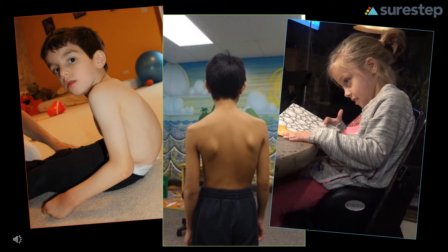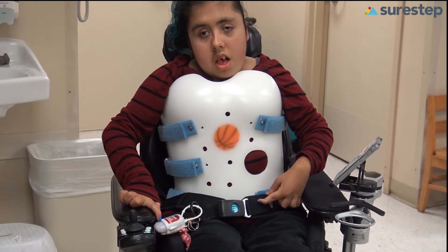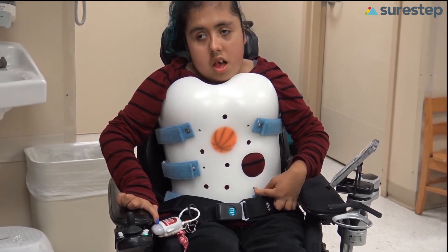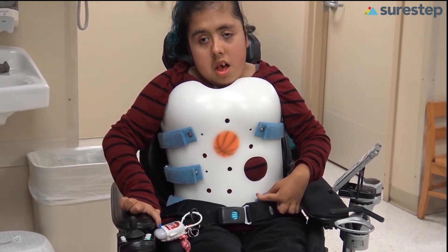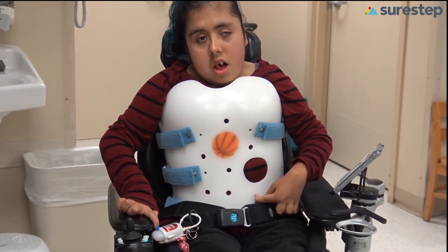Do you see patients who need support to sit on the floor or in their seating systems? What about patients who are experiencing back pain or struggle with fatigue because they're working so hard to breathe and maintain their posture? Do you hesitate to put rigid TLSOs on these patients because frankly you don't see improvement, or they wind up sitting in a closet because the kiddo can't function or breathe in it?